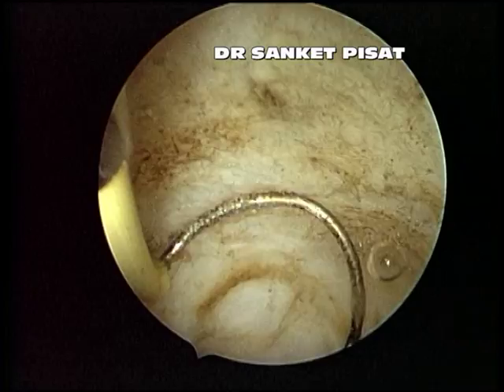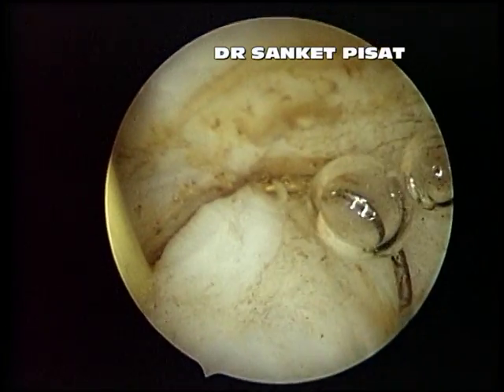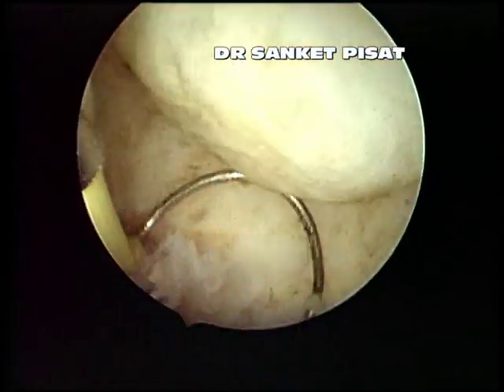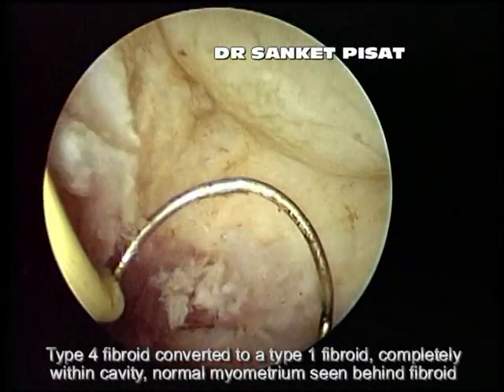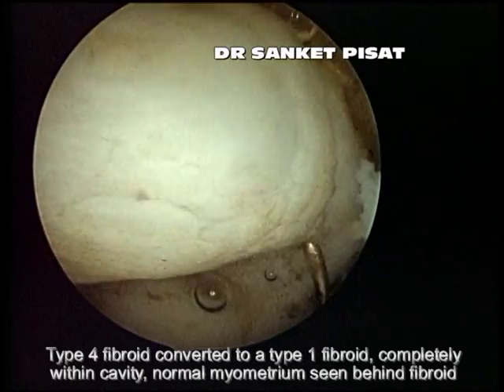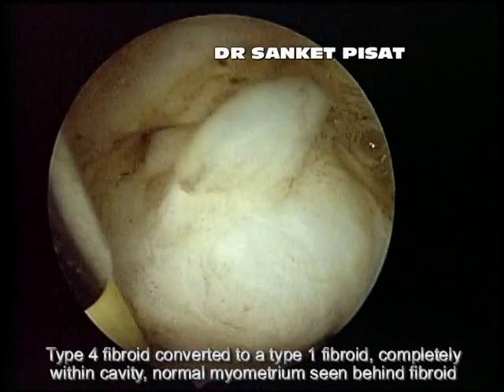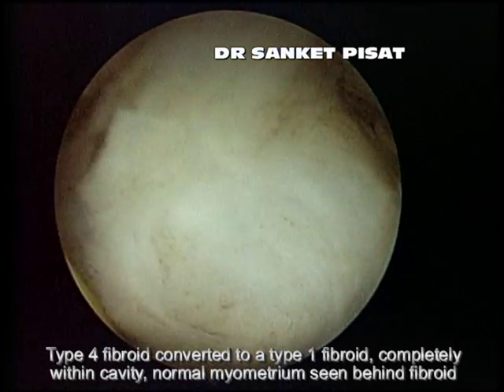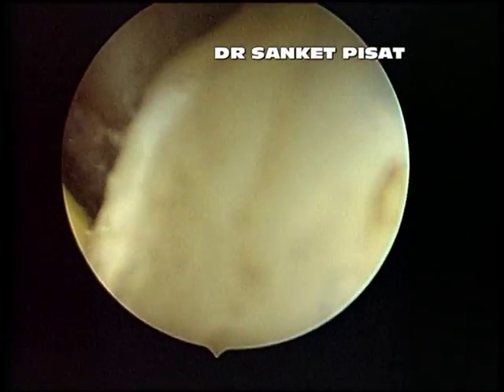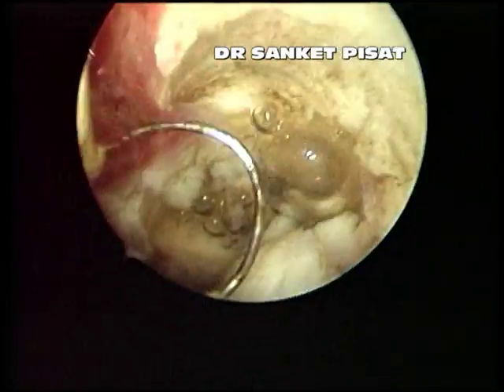As we can see here, the fibroid is slowly but surely getting displaced towards the endometrial cavity until such a point that the cold loop of the resectoscope is able to lift the fibroid away from its attachment, thereby exposing the normal pink myometrium behind the fibroid. Effectively, a type 4 fibroid has been converted into a type 1 fibroid, completely eliminating the need for burrowing into the uterine cavity and thereby increasing the risk of perforation.